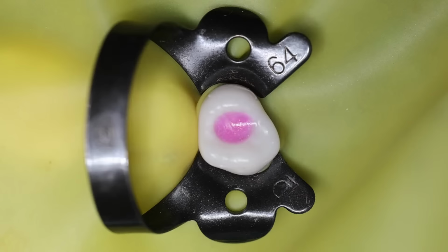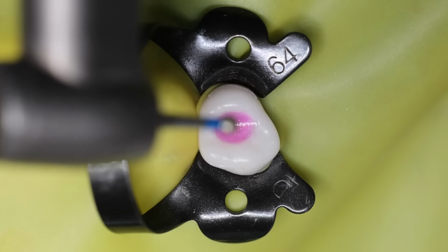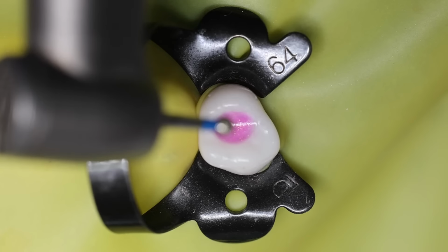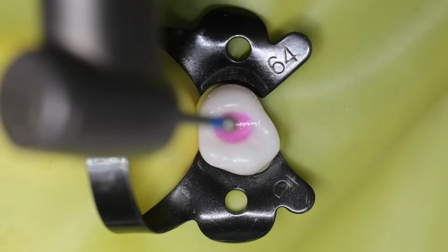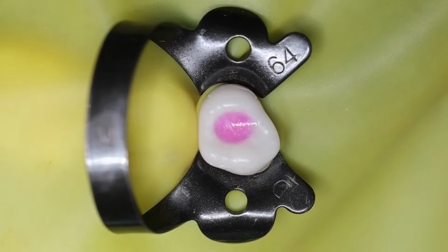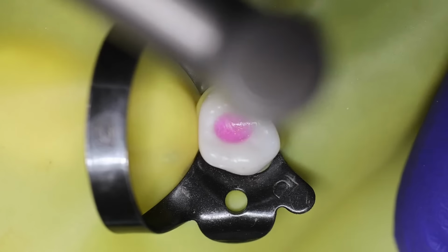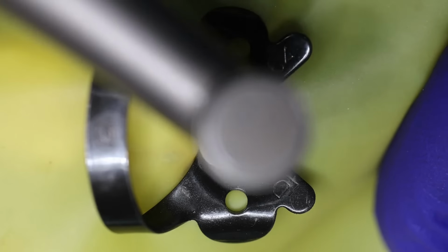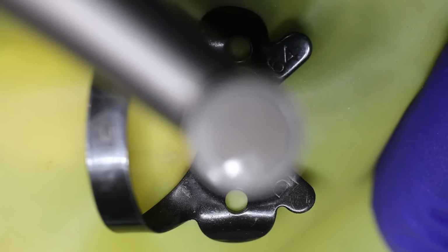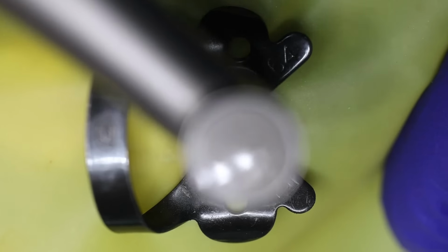Okay, so the first thing that we should consider is you can begin with a round burr, basically a diamond point, or even you can use slow speed carbide burrs for removing the caries and gaining access into the pulp chamber. So to achieve this we will begin with the removal of the restorations that we had done, and we will prepare the access cavity so that we are into the pulp chamber. So let us begin now.